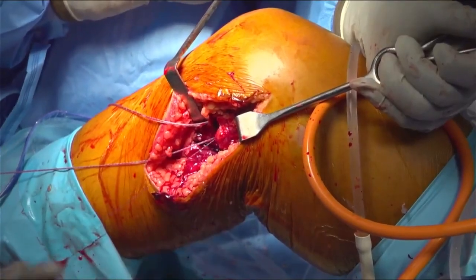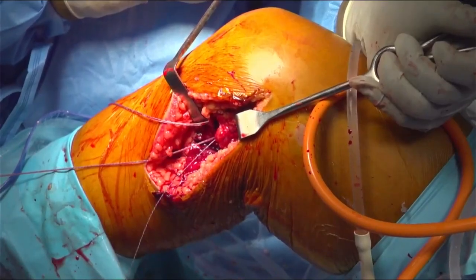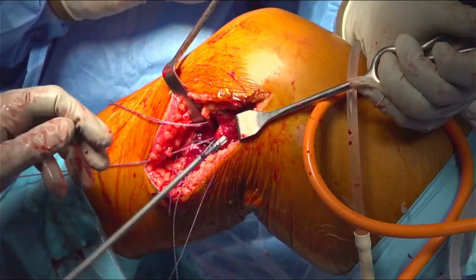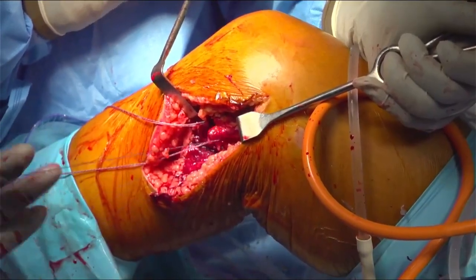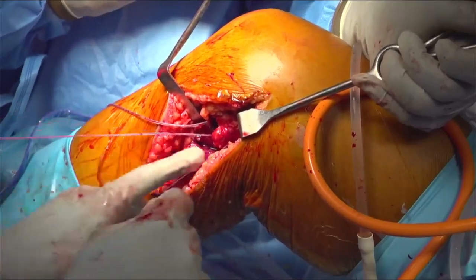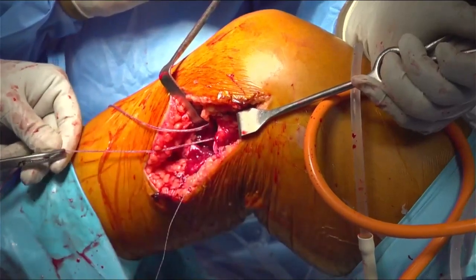So this is our first pass ST suture device. Visual up. And we will be passing the sutures one by one using the first pass ST device. So this is the first one. Second please.